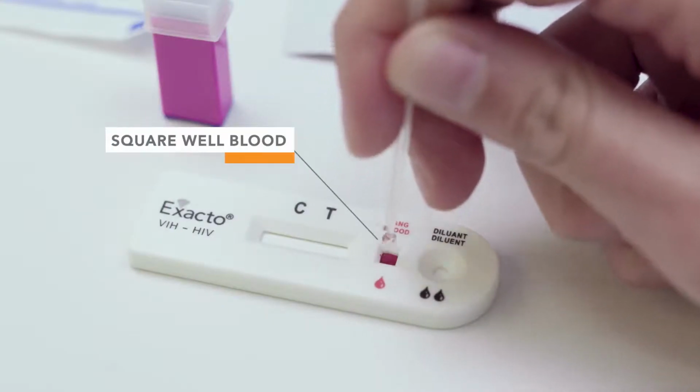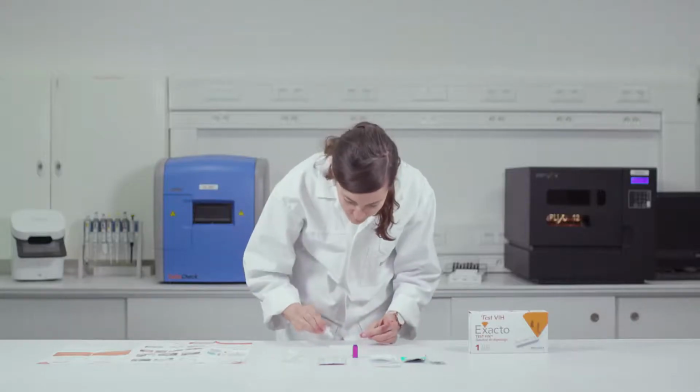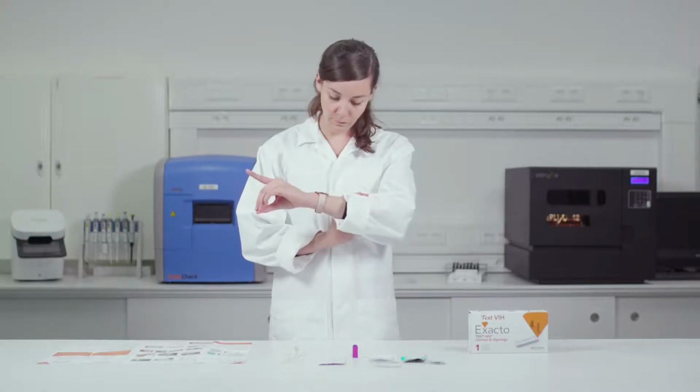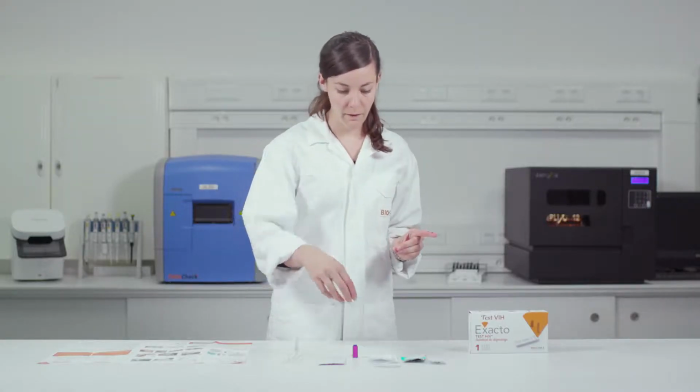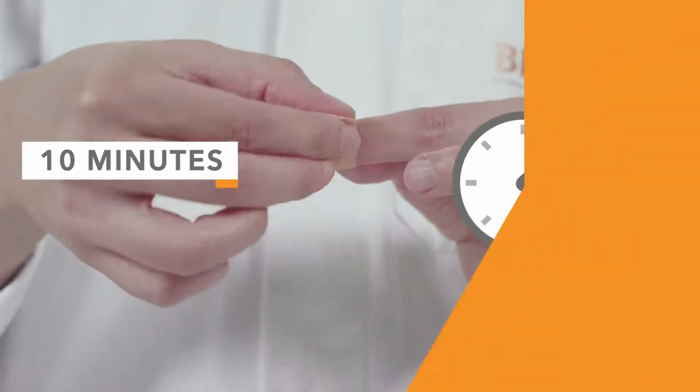Place the drop of blood into the square well. Make sure the bottom of the square is covered completely in red. Place 2 drops of diluent in the round well. Wait 10 minutes for the results. During this time, apply the provided plaster on the area that was punctured.